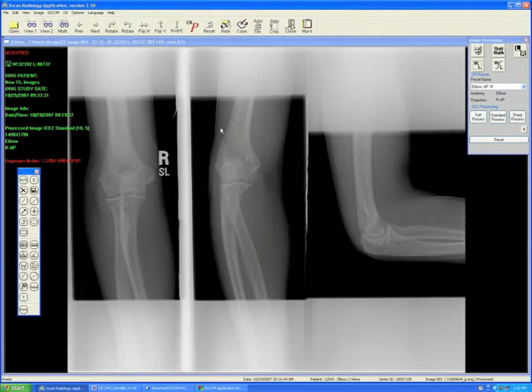However, I think it's important for me to point out to you that if you are going to do x-rays in this fashion, where you're putting multiple images on a plate, that you do use your lead strips to protect your exposed as well as your unexposed areas of your plate so that you avoid fogging your image with scatter.